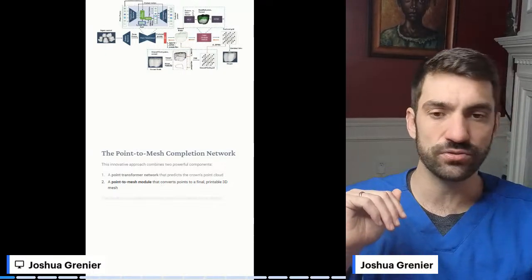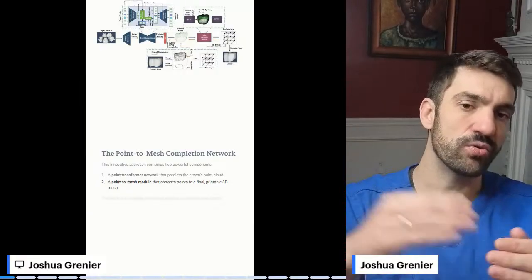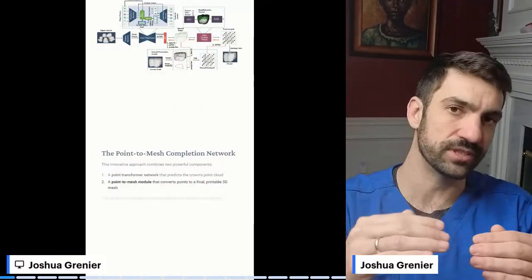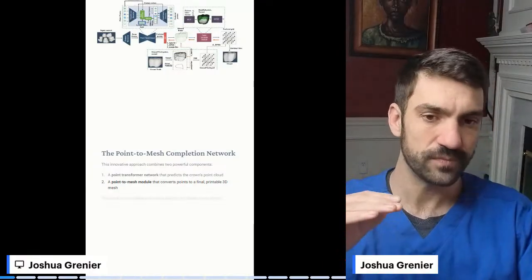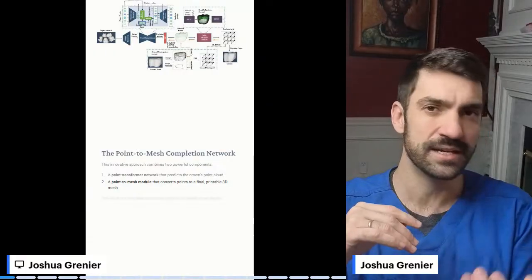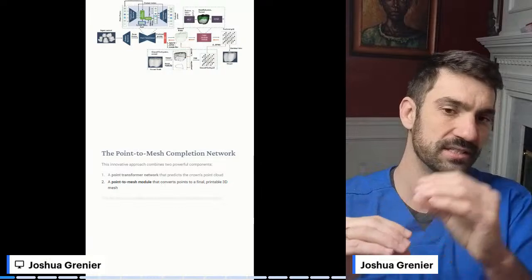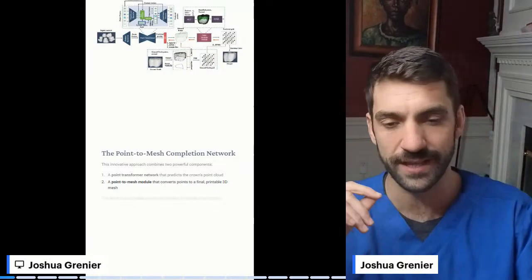And then it's using a transformer model, using a dynamic amount of questions. So it can essentially ask questions continuously. Where would this point go? Where would be the best feature region? And it can spit out a potential point for this, which is then used to generate a crown, sort of like ChatGPT generates the next piece of text based on what it's already seen. This is essentially what it's doing, where instead of spitting out text, it's spitting out points on a point cloud.